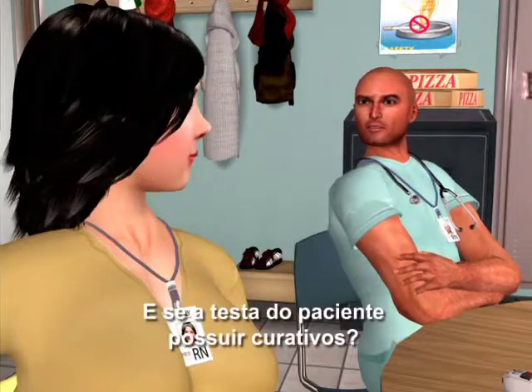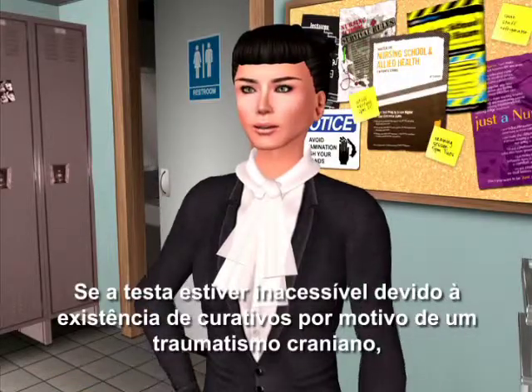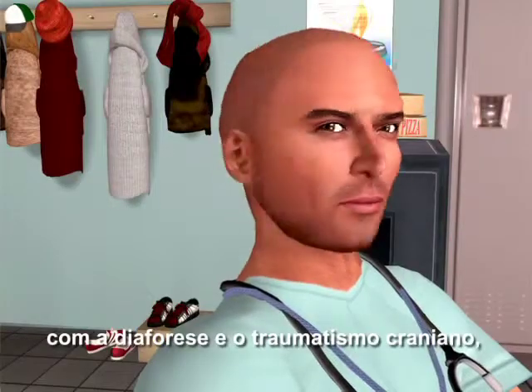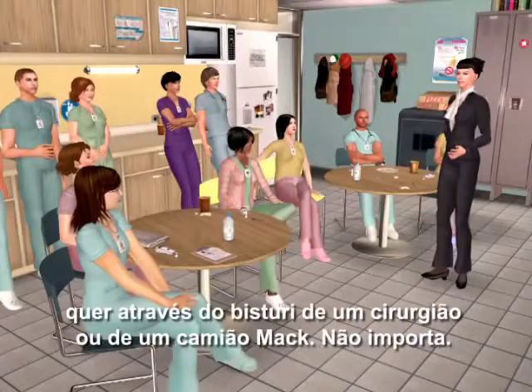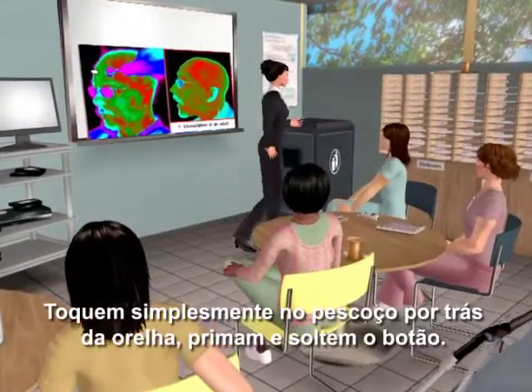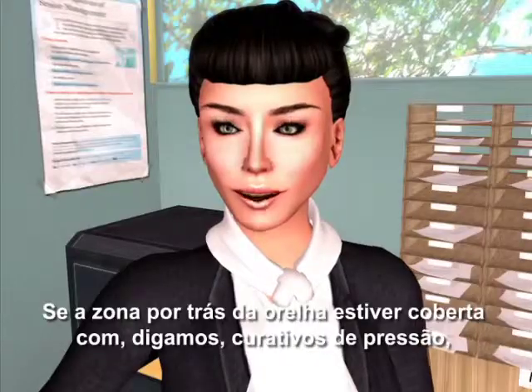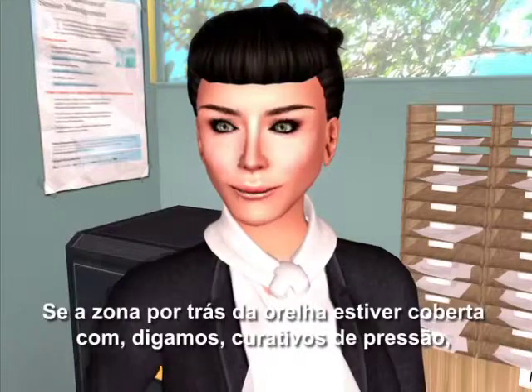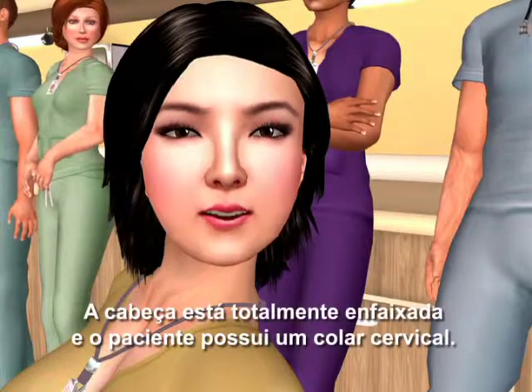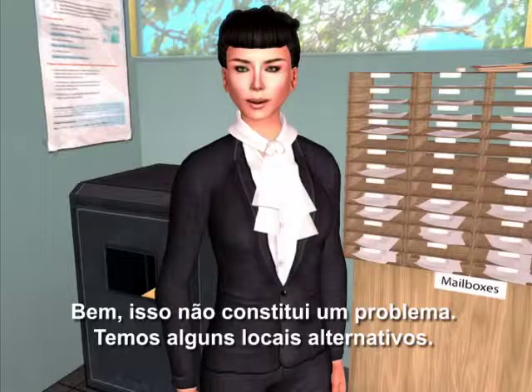What if the patient's forehead is bandaged? If the forehead is inaccessible because of bandages due to head trauma — remember, vasodilation in the neck is assured with both diaphoresis and head trauma, whether from a surgeon's scalpel or a Mack truck — just touch the neck behind the earlobe, press and release the button. If behind the earlobe is covered with pressure dressings, just scan the part of the neck that's accessible. If the whole head is bandaged and the patient has a cervical collar, no problem — we've got a few alternative sites.